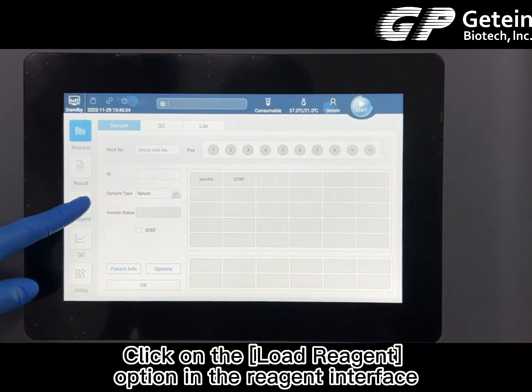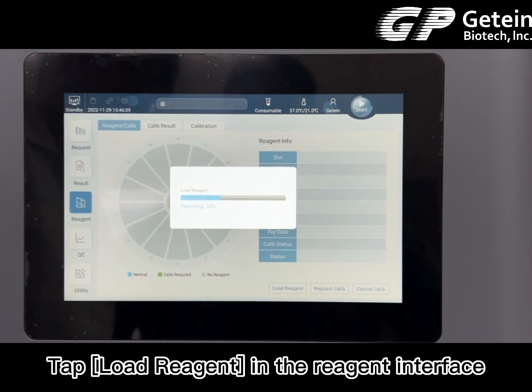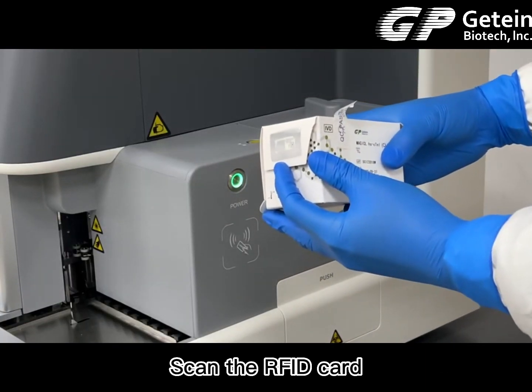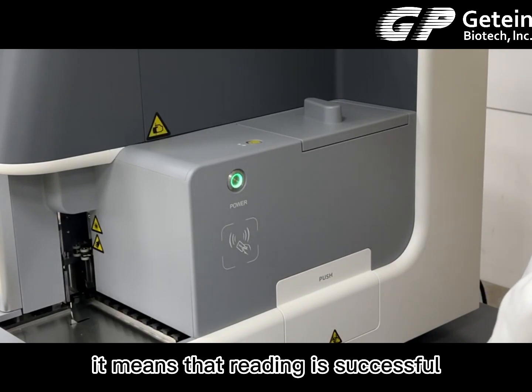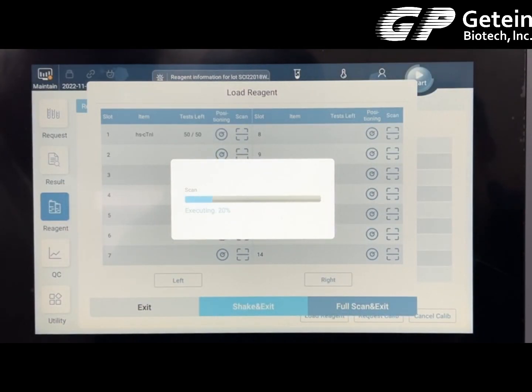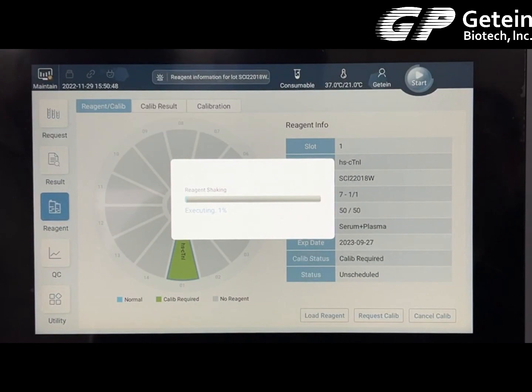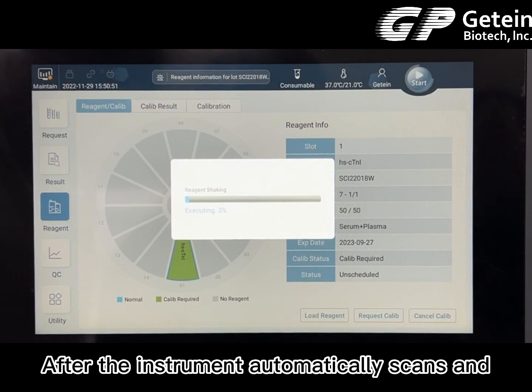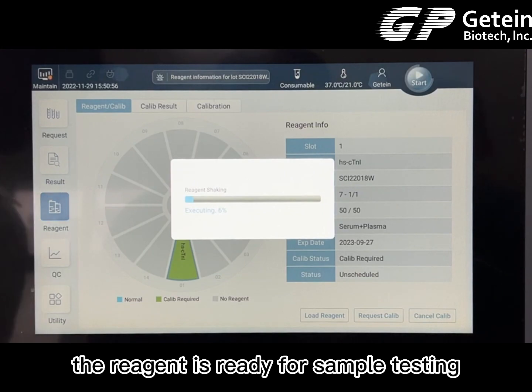Click on the load reagent option in the reagent interface. Tap load reagent, then scan the RFID card. When you hear the beep sound, it means reading is successful. Tap the scan button in the corresponding position, then tap shake and exit. After the instrument automatically scans and mixes the reagent, the reagent is ready for sample testing.